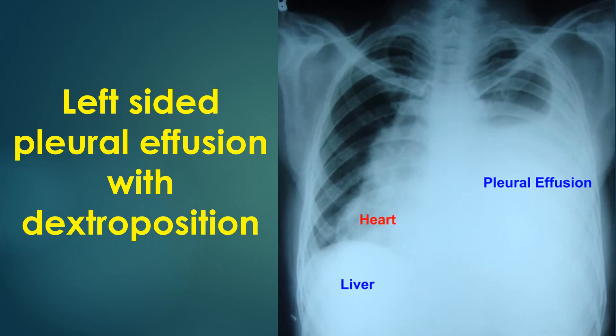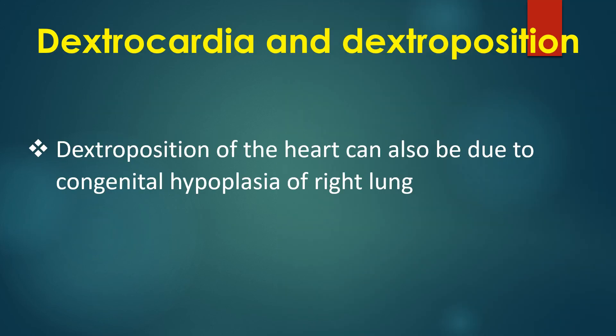In this chest X-ray, there is massive pleural effusion on the left side, pushing the heart along with the mediastinum to the right side, producing dextroposition. The higher level of the effusion in the axilla is evident. The liver shadow is on the right side, indicating situs solitus. The stomach air bubble is not clearly visible. Dextroposition of the heart can also be due to congenital hypoplasia of the right lung.